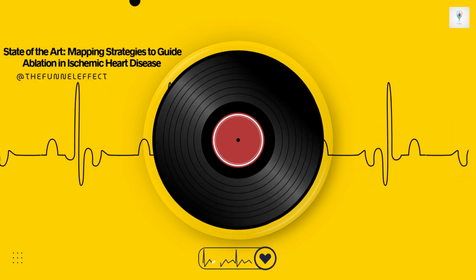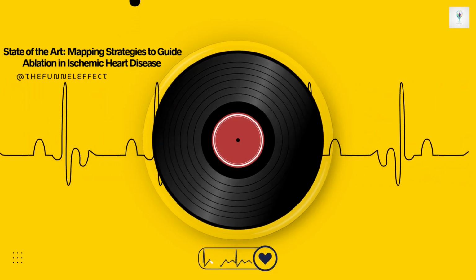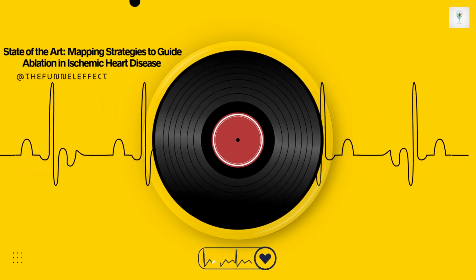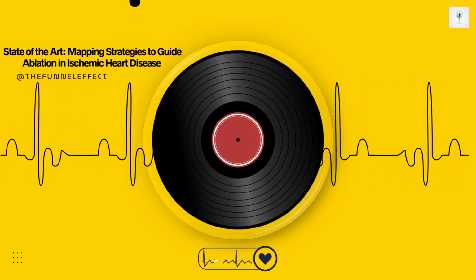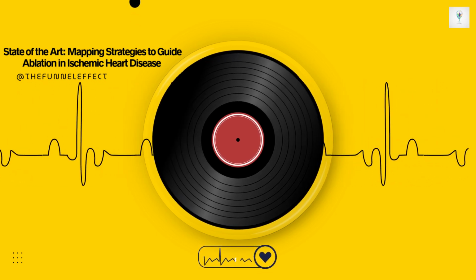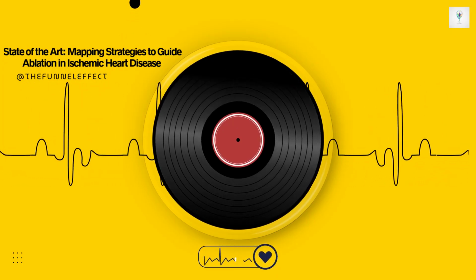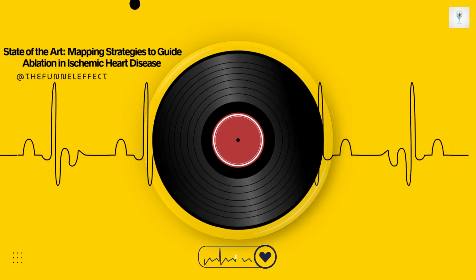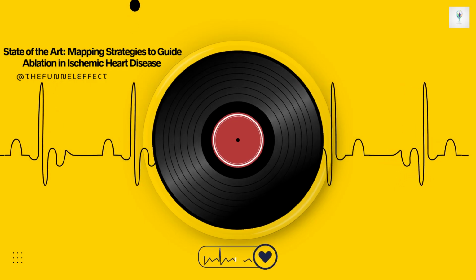Activation mapping suggests where the circuit is, but the gold standard for proving a specific site is part of that circuit is entrainment mapping. The pacing proof, you called it. Can you break down how that works? Right, entrainment is incredibly powerful for confirming causality. The basic idea is this. You pace the heart from your catheter tip at a rate slightly faster than the ongoing VT. Let's say the VT cycle length, VTCL, is 400 milliseconds. You might pace at 380 milliseconds.